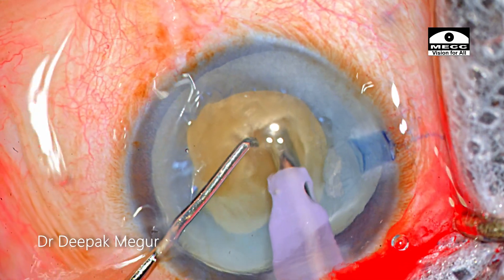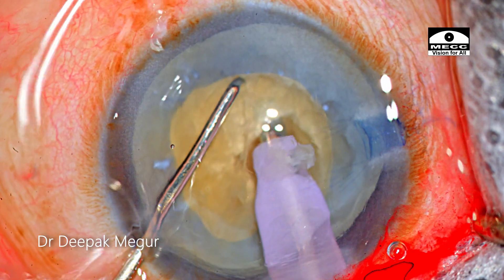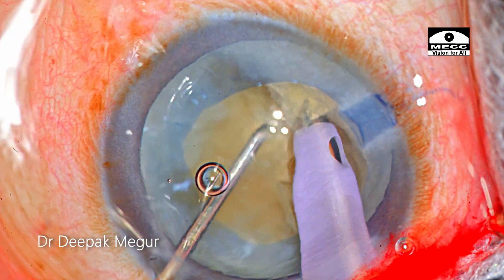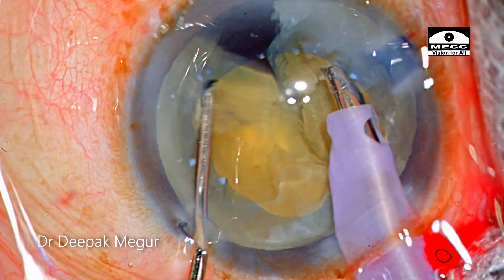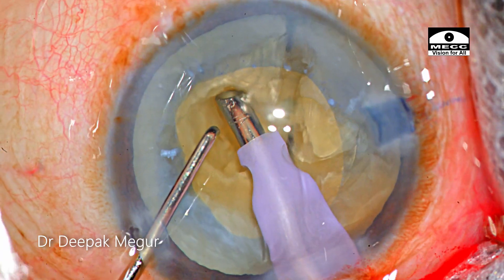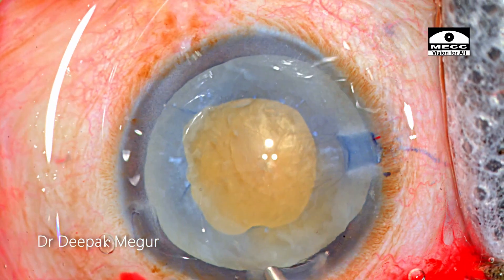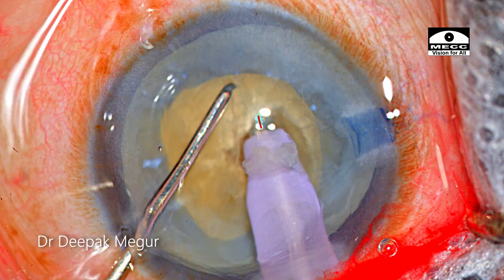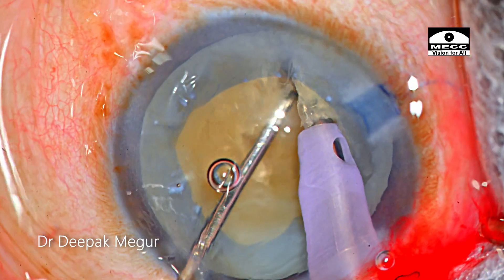Moving on to the direct chop technique — a few fundamental principles need to be understood. The secret to achieve any chop is to have a firm grip on the nucleus. This is easier with a wider-bore tip that has a larger surface area to bury into the nucleus. With thin tips where surface area is small, the holdability may not be great, and during chopping maneuvers a torque force can be introduced causing rotation of the nucleus and an inefficient division. So in harder cataracts with thinner tips, the key is to bury the tip as deep as possible — until we reach the sleeve — to get into the core of the nucleus, ensuring better grip and easier chopping.